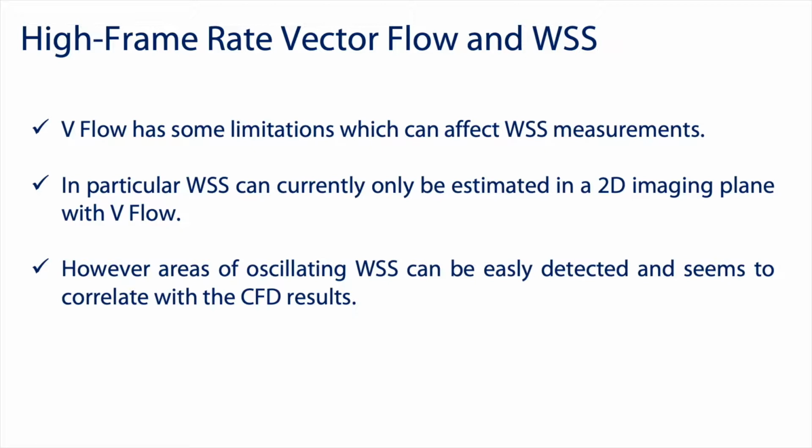Preliminary research findings are encouraging and show that high frame rate wall shear stress values seem to be comparable with the CFD wall shear stress ones. And if the preliminary findings will be confirmed, high frame rate vector flow could identify patients at a high risk of plaque development or plaque rupture.